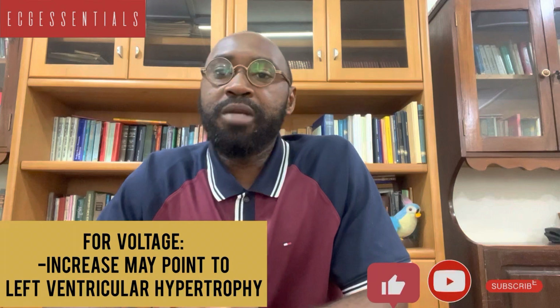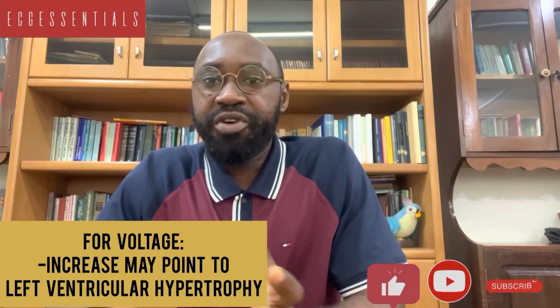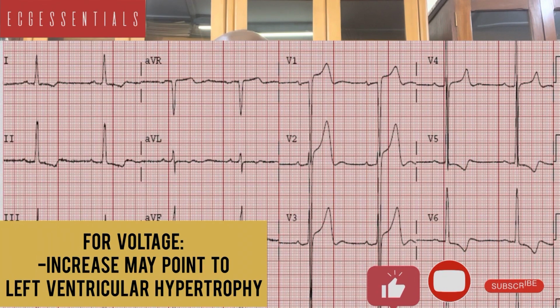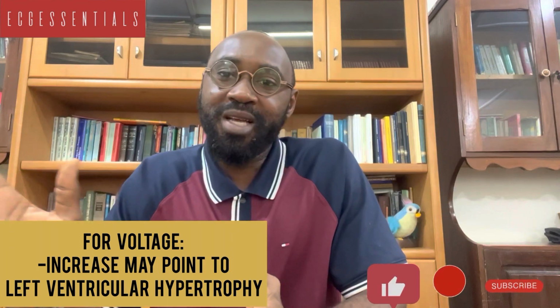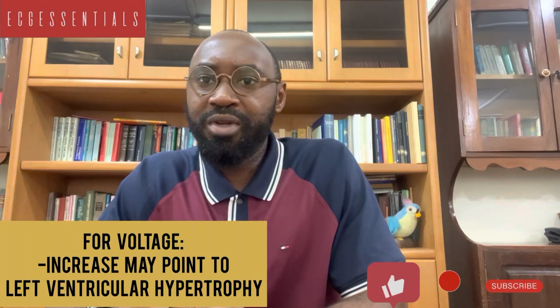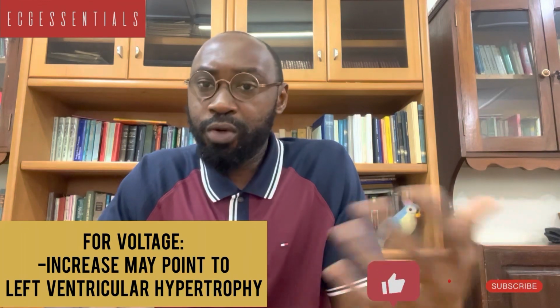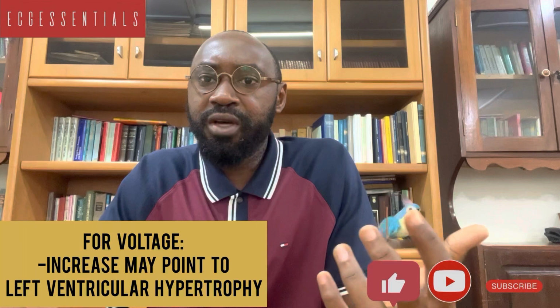With respect to the voltage of the QRS complex, when the voltages are increased, it may usually be representative of, say, left ventricular hypertrophy. Of course, there are so many criteria that may be helpful in trying to establish that hypertrophy. We will not talk too much about it yet because we'll be discussing hypertrophy in much detail. But as we all know, some of the most common criteria include the Sokolow-Lyon, the Cornell, the modified Cornell, and a whole lot of other criteria.